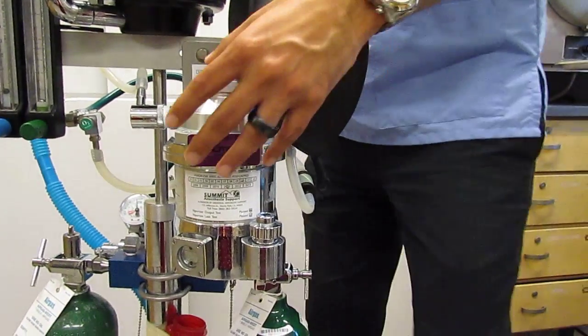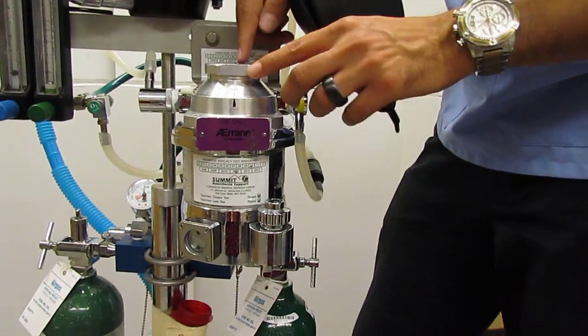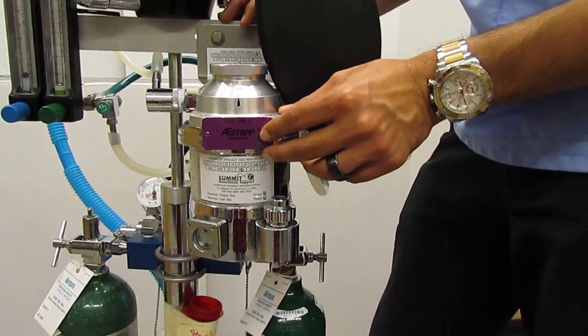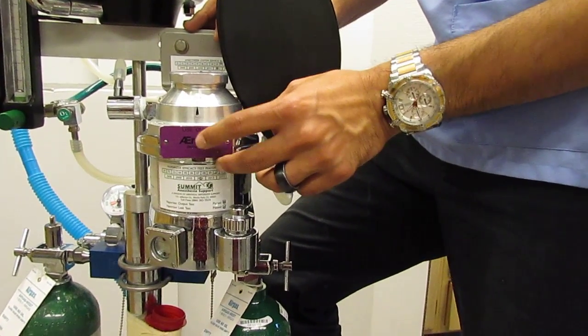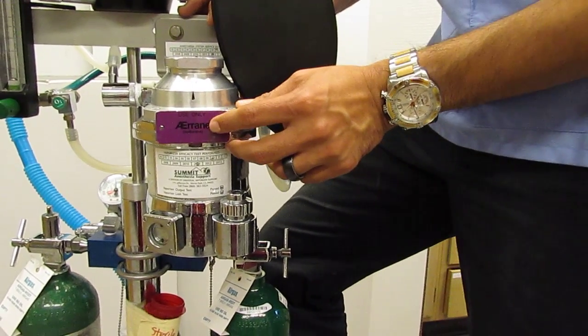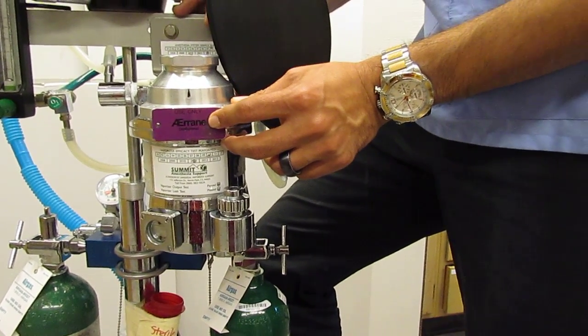Remember what we talked about in lecture? The precision vaporizer is a specialized device calibrated to be used specific to a certain machine and it's specific to that, I'm sorry, to a certain gas, and it's specific to that gas's vapor pressure, okay?